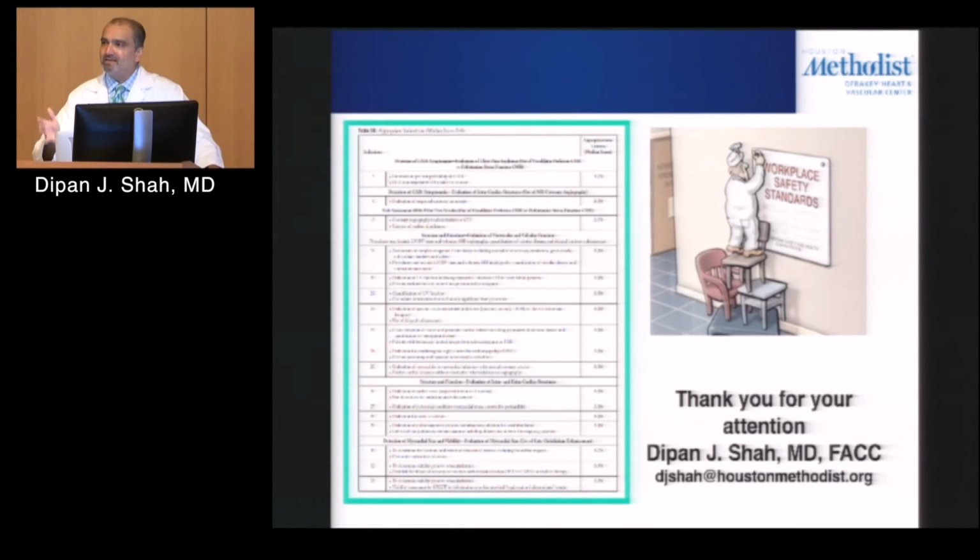If a patient has not had any prior assessment of LV function, and they have heart failure, they definitely need assessment of LV function. Typically, you would start with echo, and if the echo is suboptimal or equivocal, then you could proceed on to something like MRI. But the flip side is, if you have a patient who, you look at the chart and they've been in the hospital every month with recurrent heart failure, that's a patient that getting a repeat echo may not be of use.